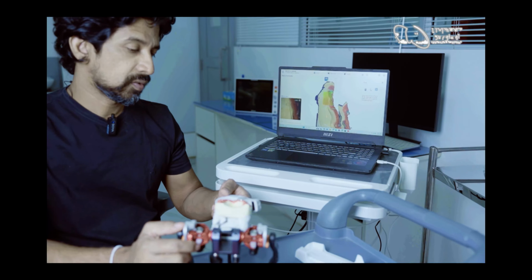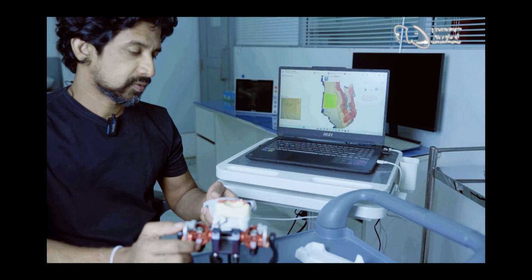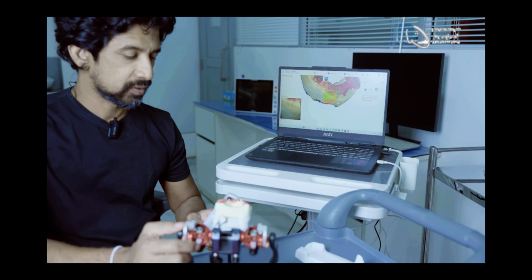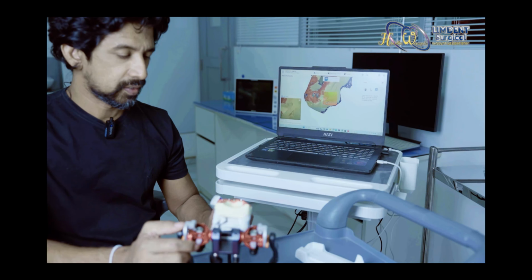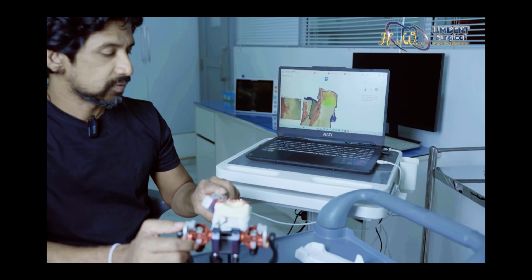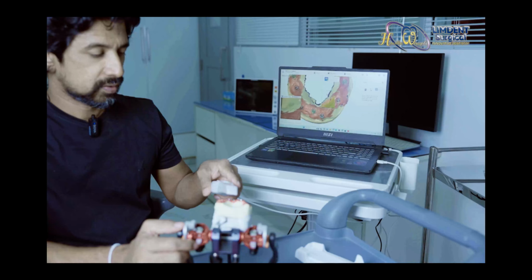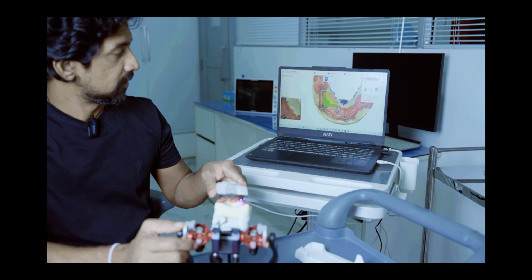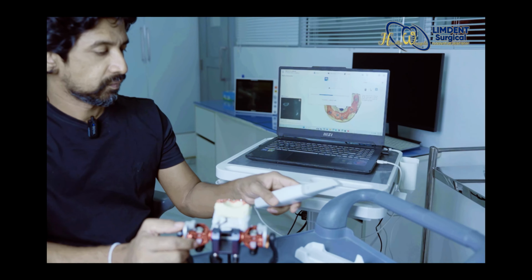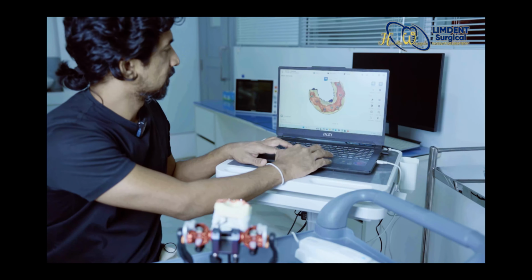I pay more attention to the labial surface of the cast to collect the data. After collecting the data of the implant bed, you will understand why I was concerned about collecting the data of the upper cast in the anterior or the labial region. So I hope that we've got proper details.